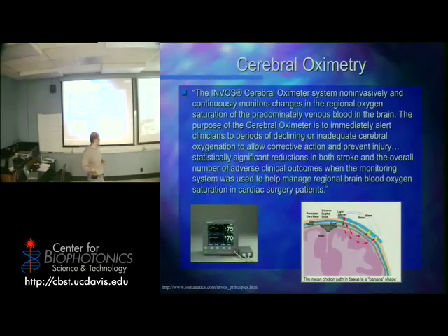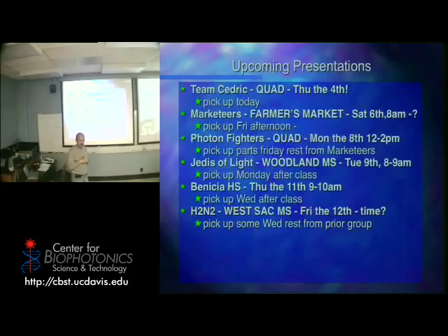The way that one works, the neonatal one, is literally a little pad that you stick on one side of the brain, stick on the other side of the brain, and you see if there's any kind of motion of blood which indicates activity. Much easier than an MRI or an fMRI, and shows you activity right away. Okay? Questions about that? So, with that, that's it for pulse oximetry. Okay? Any questions in general?